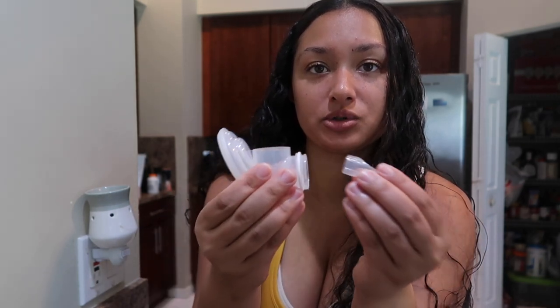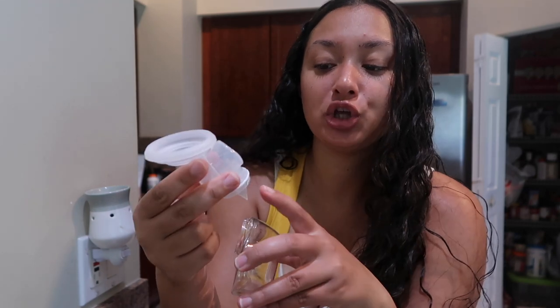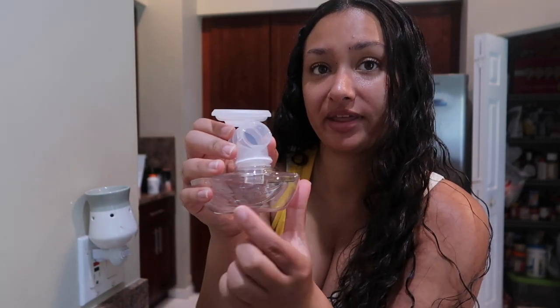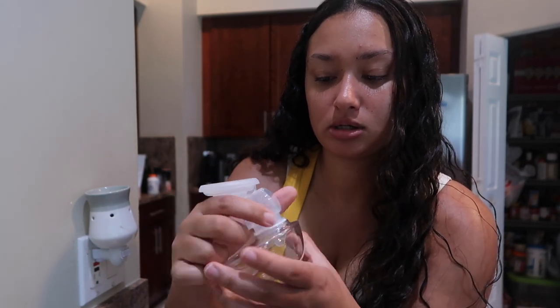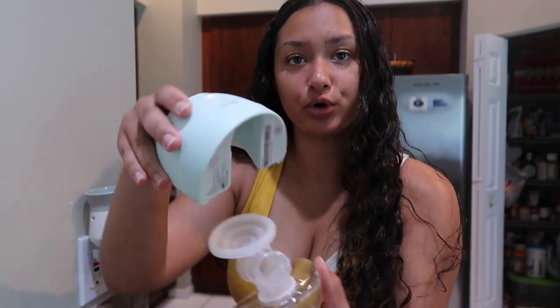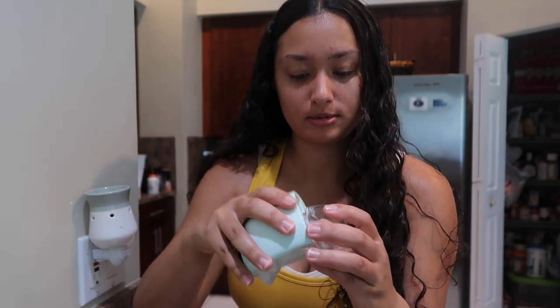And then next, you're gonna take the valve and put it in right here. See, it just goes like this. Then you're gonna take the body and just connect these two things. You want the close part of this to be showing the same as where the ounces is. So I'm gonna do it like this and it will just go in like that to lock. Next, you're gonna go ahead and put it into the motor and it'll slide right in like this. And you'll hear a click once it's in correctly.